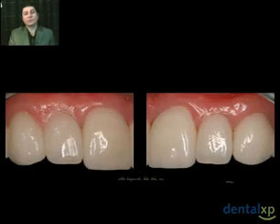Access to the screw is toward the lingual. Consequently, we have a completely screw-retained restoration. In this young man, his name is Stuart, he has a ceramic restoration on 6, a ceramic restoration on 8, tooth borne, ceramic restoration on 9, ceramic restoration on 11, tooth-borne, and 7 and 10 are implant retained restorations, ceramic also.